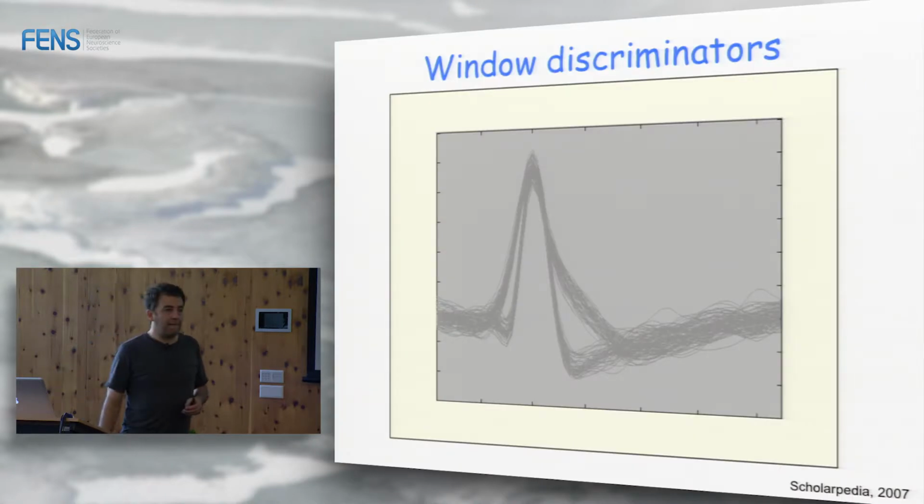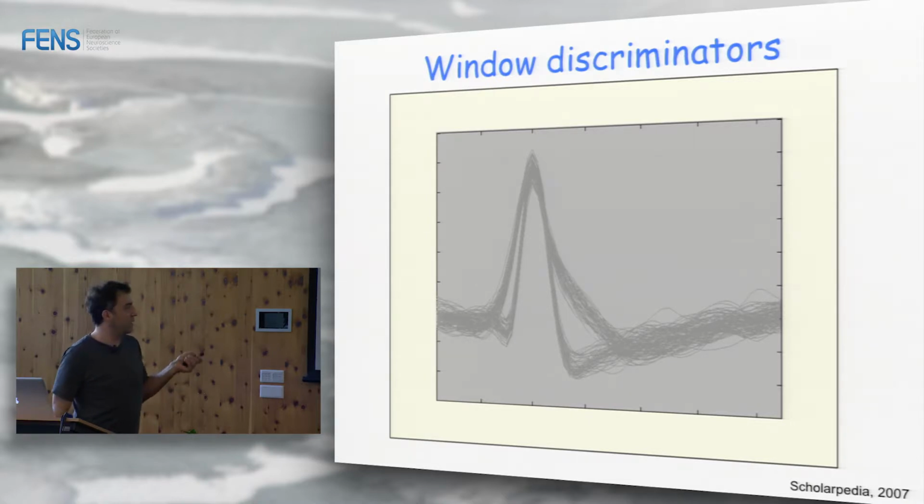Okay, now, how do we do this separation? There are many, many methods. This is the most trivial one, but I show you this because it will give you an idea of how things can be done. If you know acquisition systems, I think this is still implemented in Plexon. Here you see by eye that you have two different spike shapes, right?